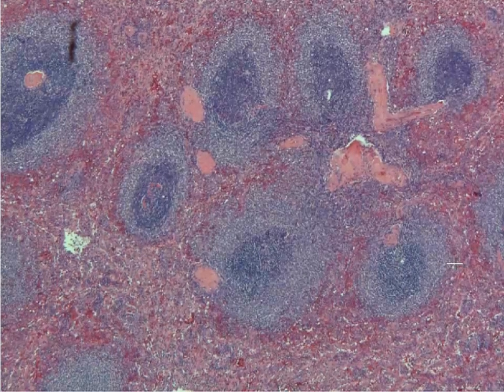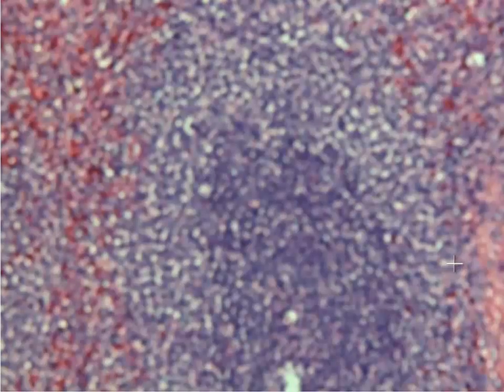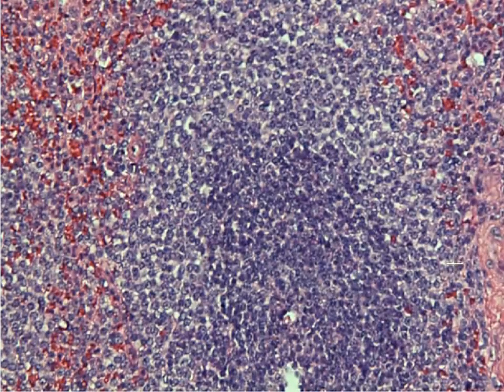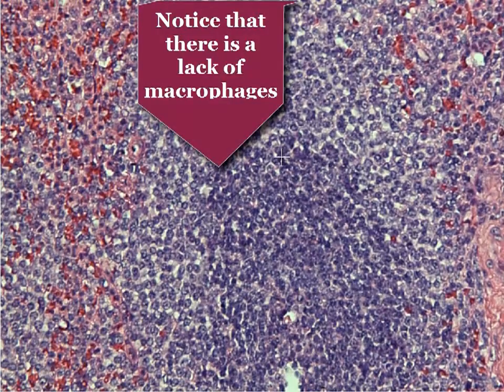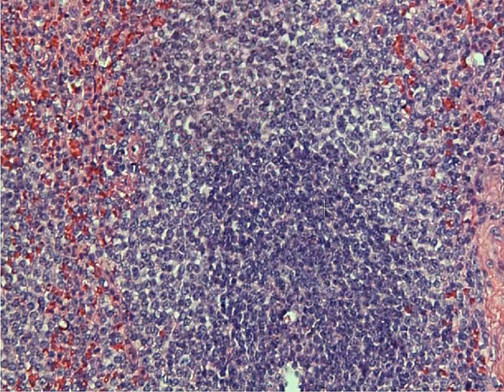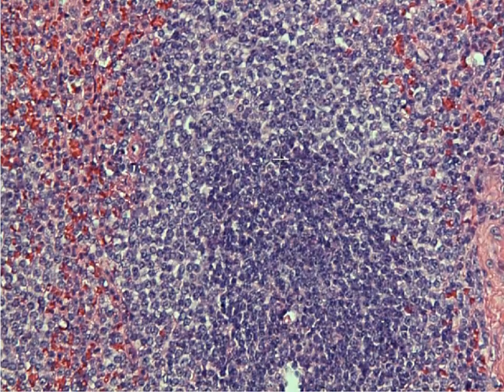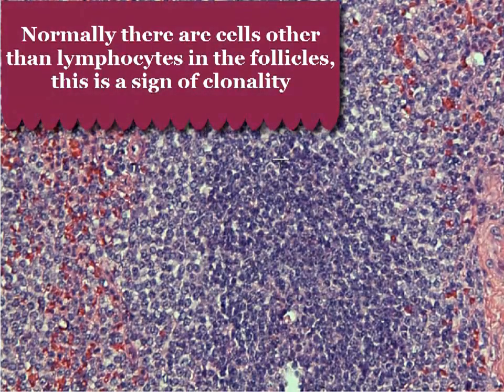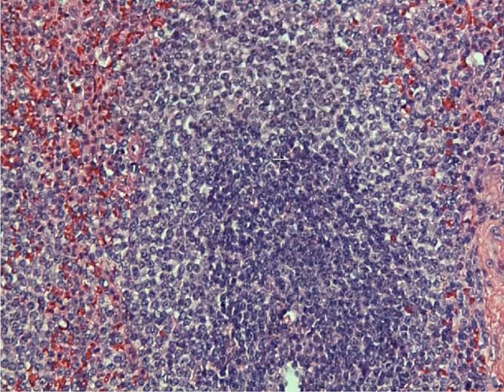You really have to go down to higher power to appreciate what's going on in these tumors. If you look at the little follicles, what you'll notice is that they're composed of a very uniform population of slightly enlarged B cells. These are the neoplastic B cells that you can see in this case. If you were to do flow cytometry, they'd be positive for CD10 and CD20, which are B cell markers. You can also do immunostains to figure this out as well.